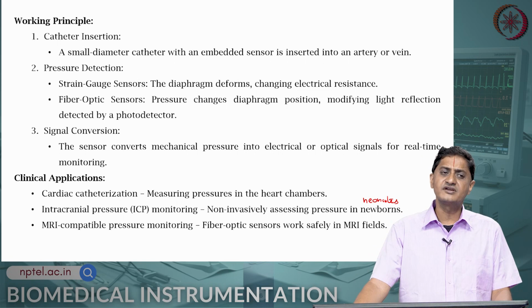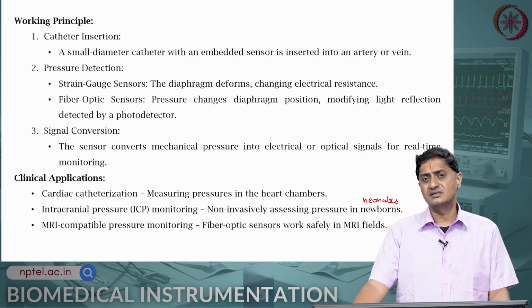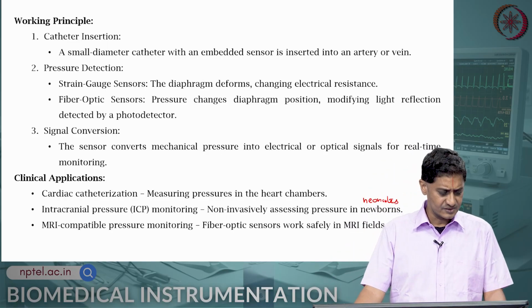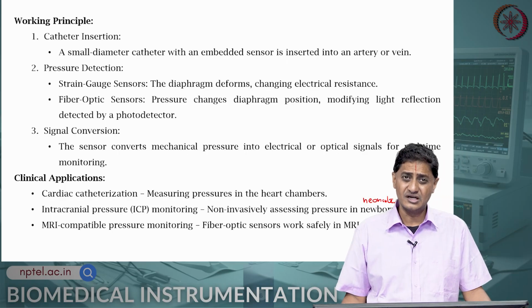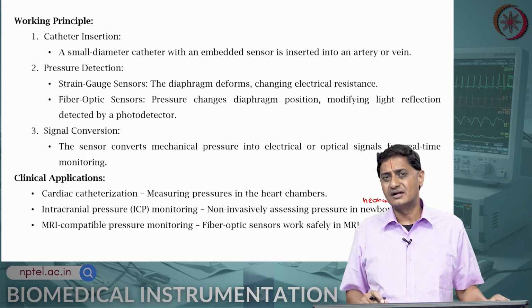Or if you are interested in having MRI compatible pressure monitoring, because we may be interested in taking an MRI while the person is being monitored for pressure changes. There are such applications, there are such needs. Several clinical applications require very fast response, high bandwidth and minimal drift.